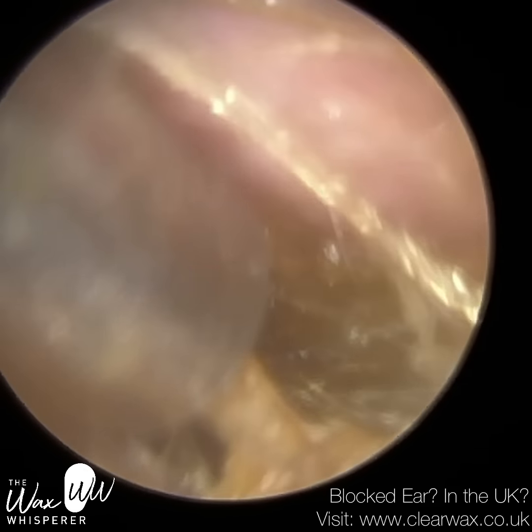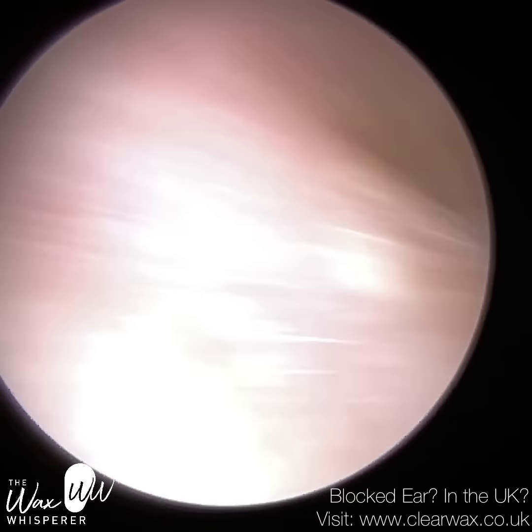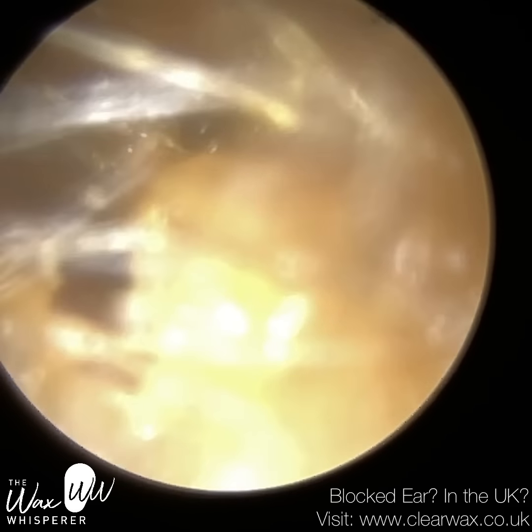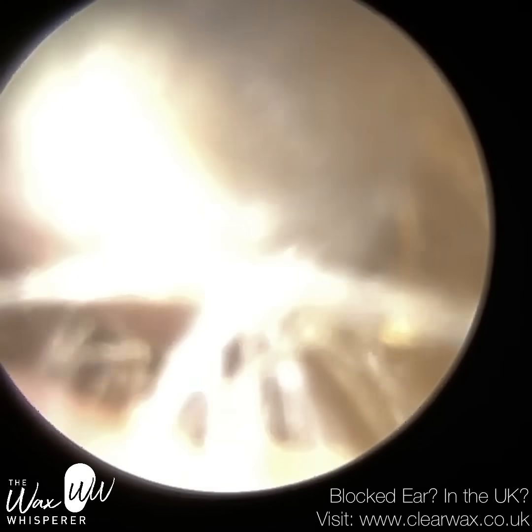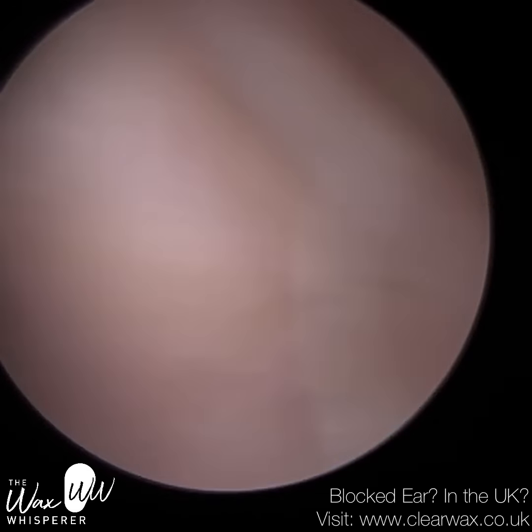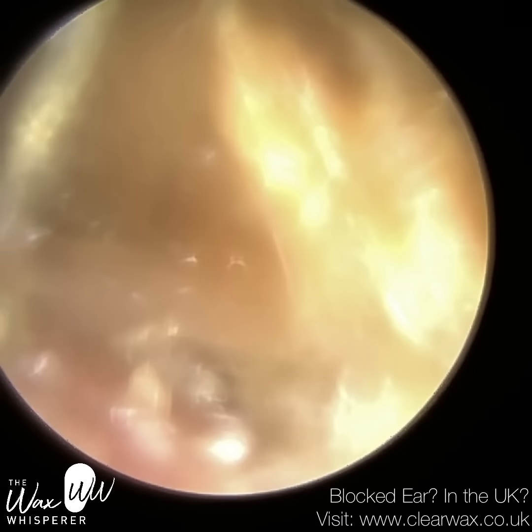They also do have a lot of hair at the entrance, as you can see here. On occasion, that can just slightly obscure the view, but it wasn't negatively impacting the procedure. If the ear is extremely hairy, I can use some forceps and almost pluck these hairs out, and that can improve the visualization of the earwax.